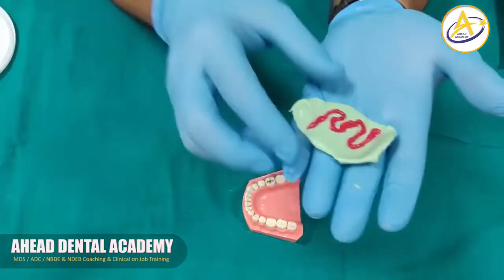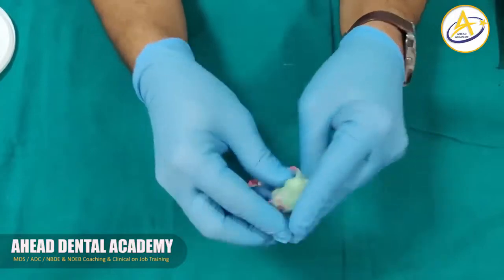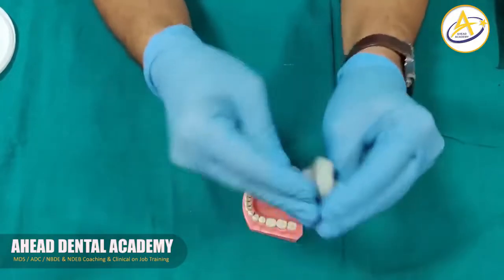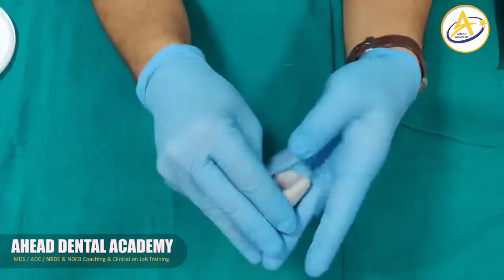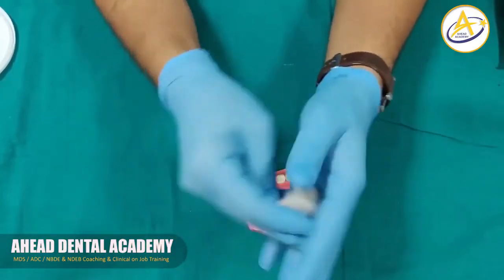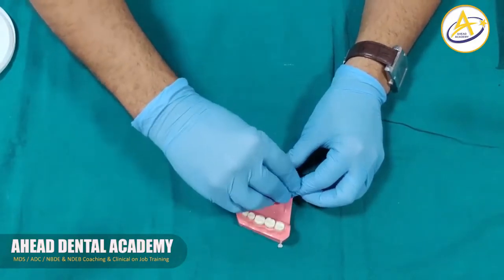So this is the putty consistency and the activator of our siloxane material. Before starting with any kind of modification to the tooth structure, we take a putty index which will help us in temporization of the tooth. So we manipulate this material till we get a uniform color, and after manipulation we adapt it over the tooth surface.